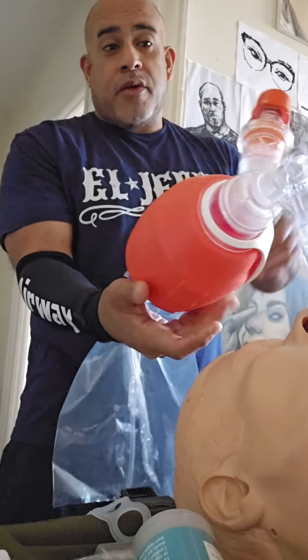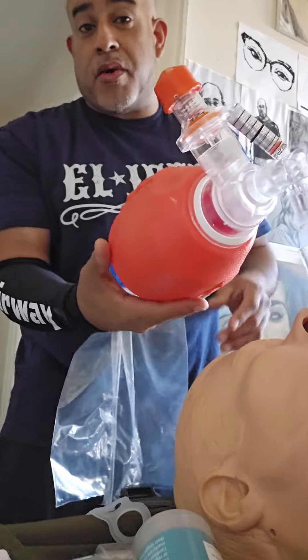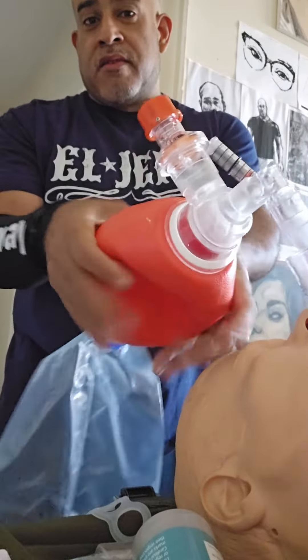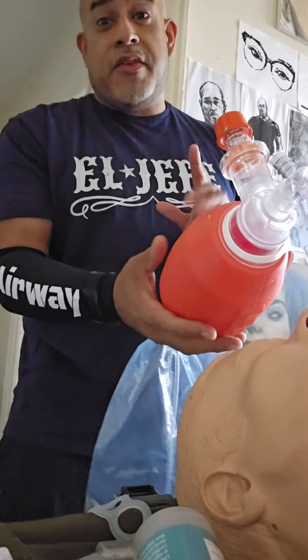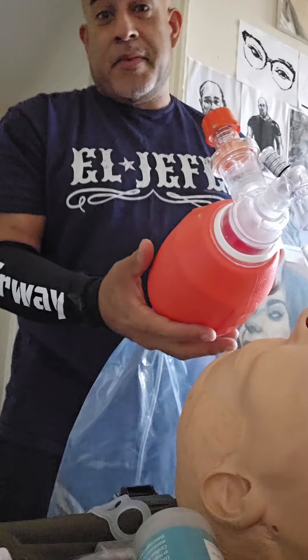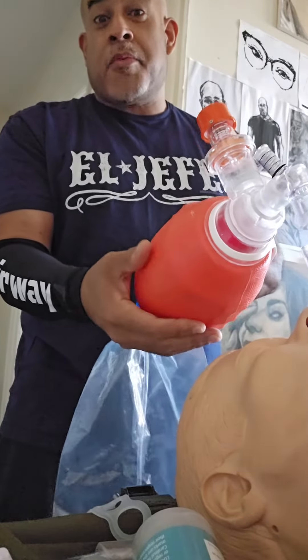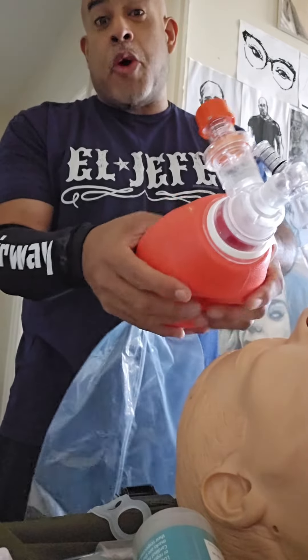Hopefully your bag has a PEEP valve, and some have manometers that prevent you from over-bagging. No one breathes that fast — quick breaths, but not banana hand breaths. Not Shaquille O'Neal-sized breaths. Slow and steady.